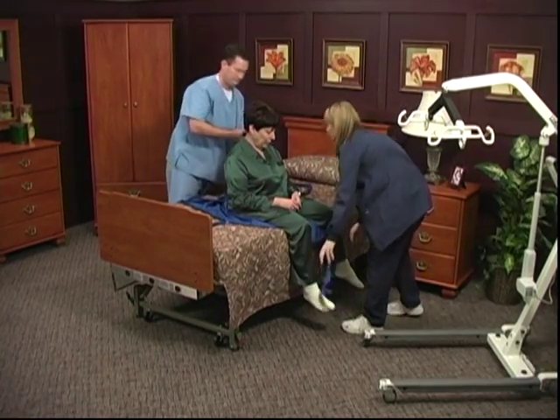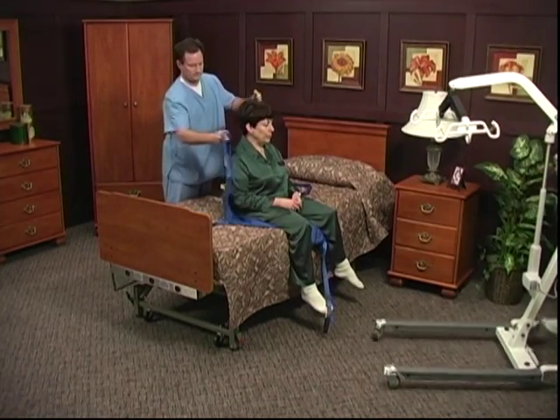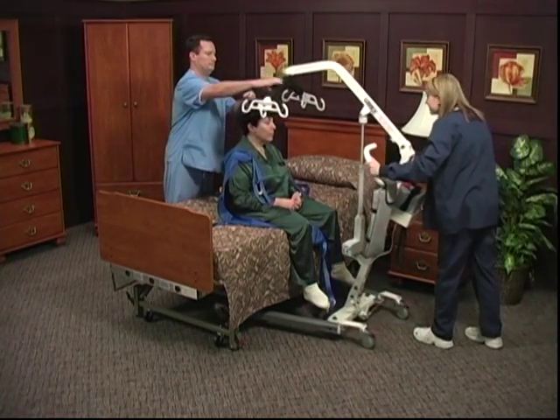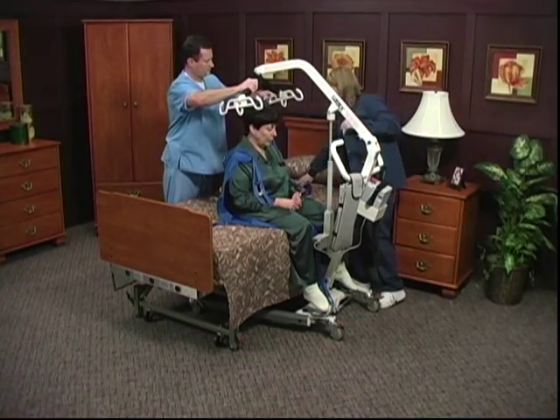A lift should always be used with two caregivers and only used for transferring a resident from one object to another, such as beds, bathtubs, chairs, or toilets. It should not be used for transporting or moving a resident from one location to another.